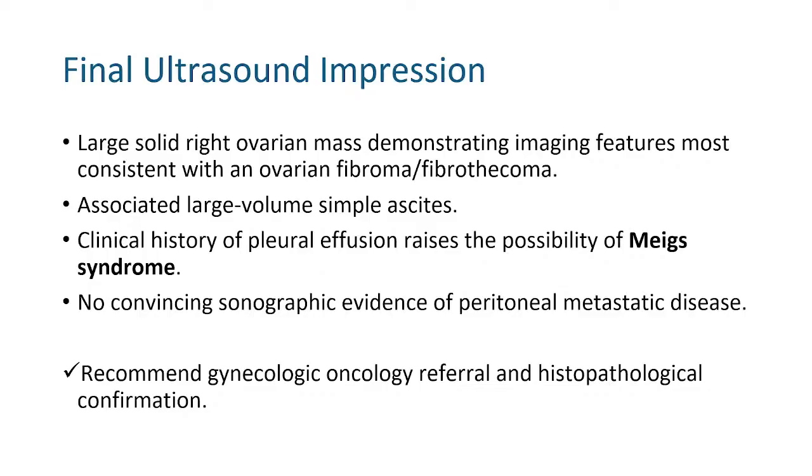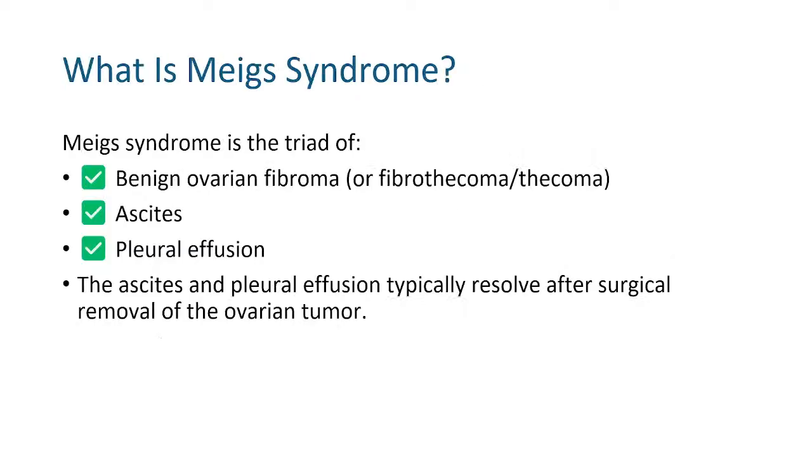So it's not simple or easy for you to quickly rush and say that this is Meigs' disease simply on ultrasound or based on ultrasound findings alone. Otherwise, you could miss ovarian cancer as well. So you must recommend gynecological oncology referral and histopathological confirmation.